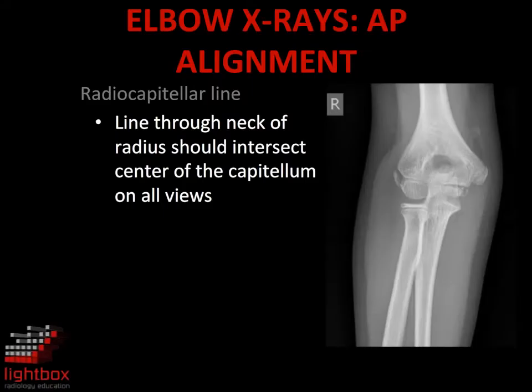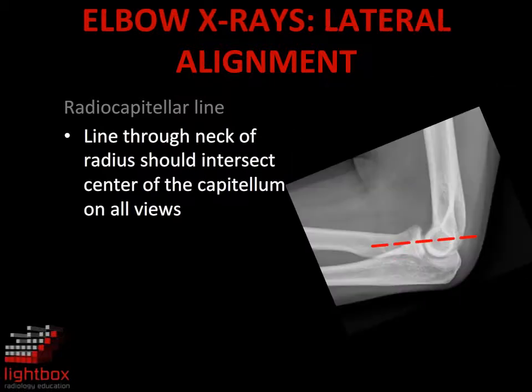As with interpretation of any extremity x-ray, we will firstly review normal alignment. If a line is drawn through the neck and head of the radius, this should bisect the capitellum on all views. This is the radiocapitellar line on the AP projection, and this is the radiocapitellar line on the lateral projection.